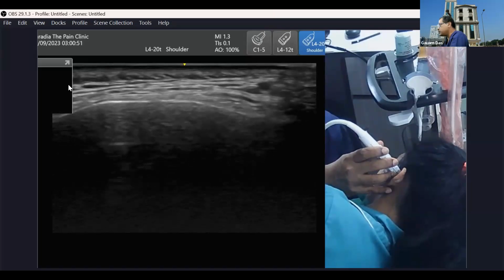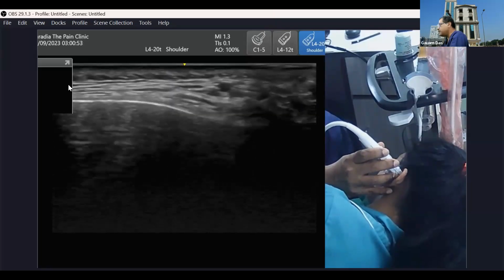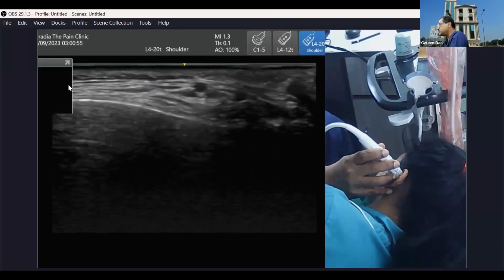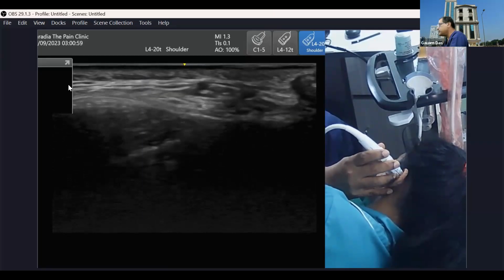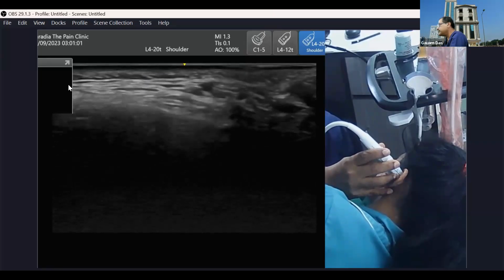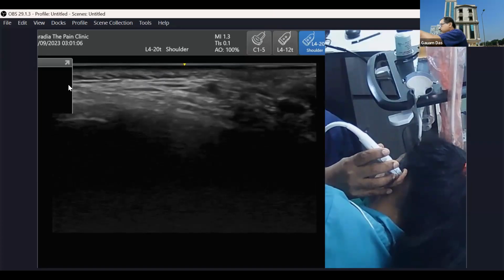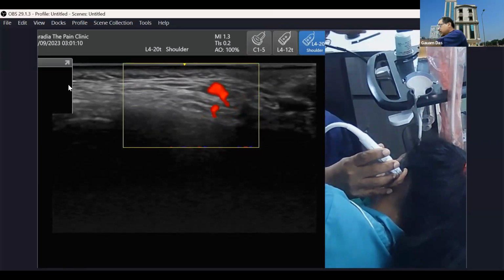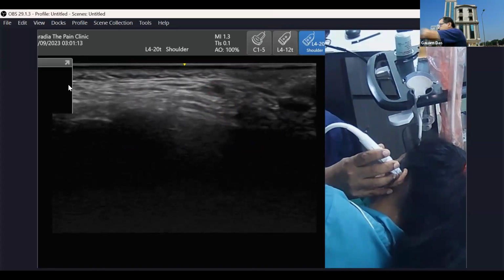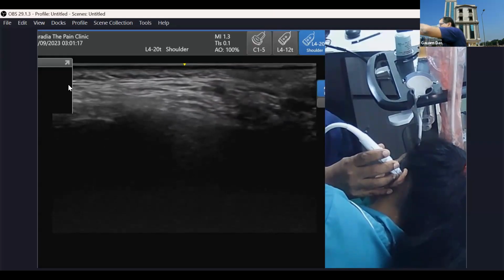And if I'm coming posteriorly towards the tragus, I'll be getting the pulsations. And just beside those pulsations, you can find the nerve. You can see the pulsations. This one. So just posterior to that, this is your nerve. Which nerve? Auriculotemporal nerve. This one. Auriculotemporal nerve.